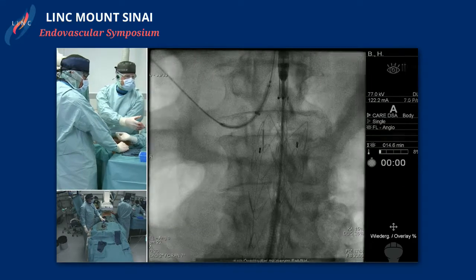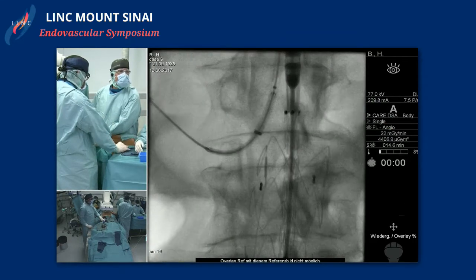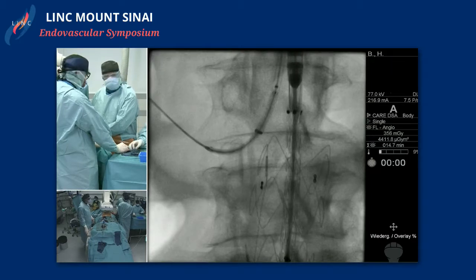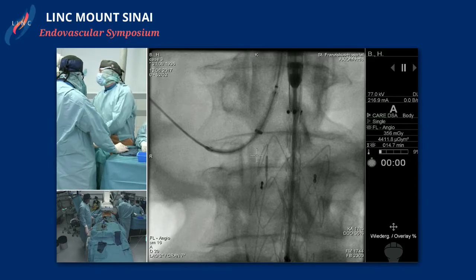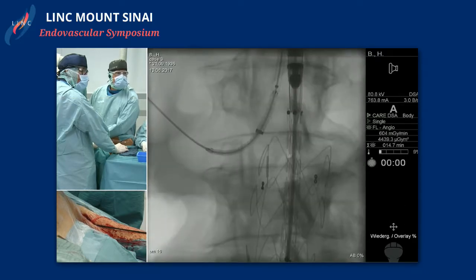Another angio. One thing in regards to you using a double stent technique, where you'll come in and use a Viabahn and then either a self-expanding or balloon expanding stent: we've converted a lot of these to actually using the VBX, which is the new Gore Viabahn with balloon expandable stents. That's very flexible. Have you had any experience with that over there yet?